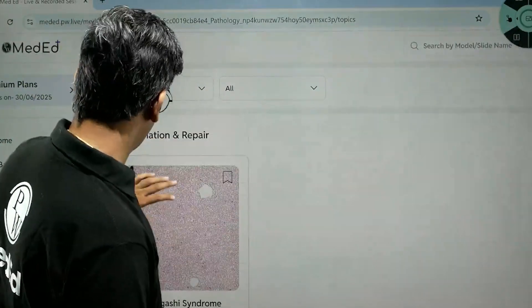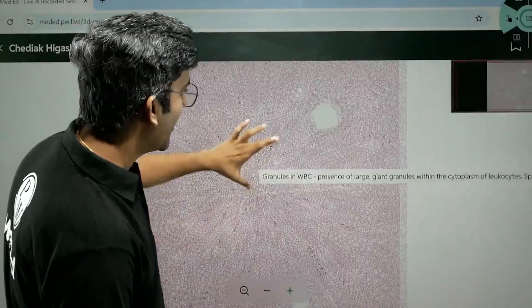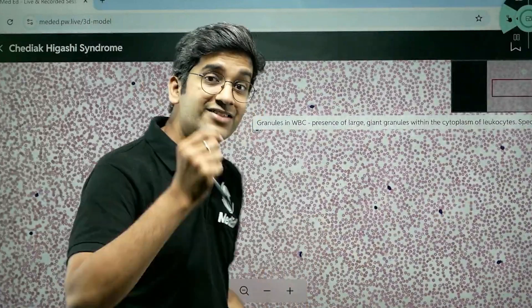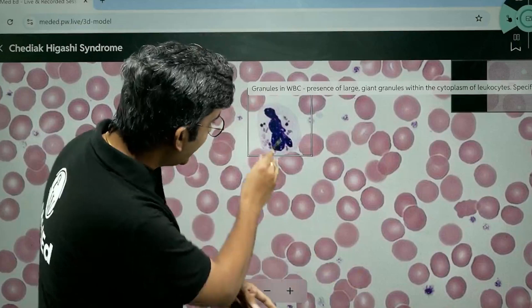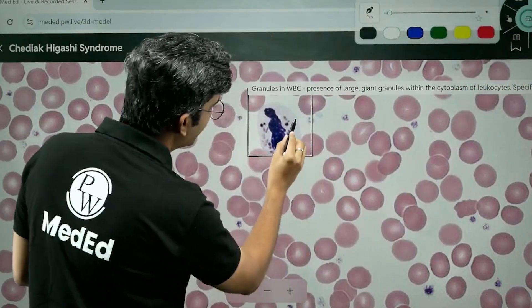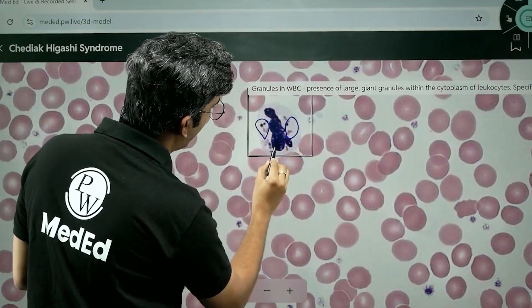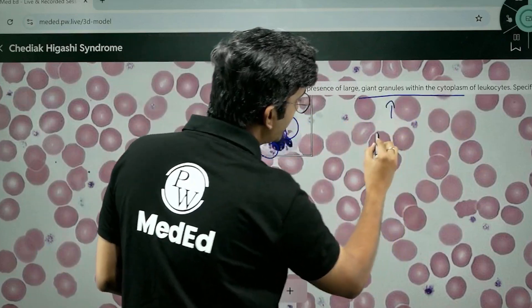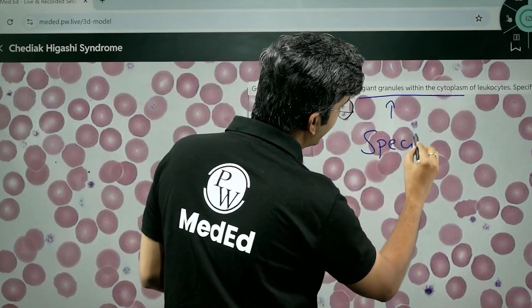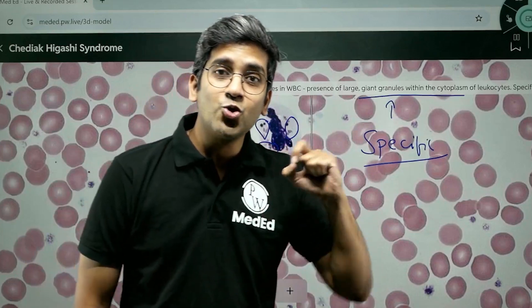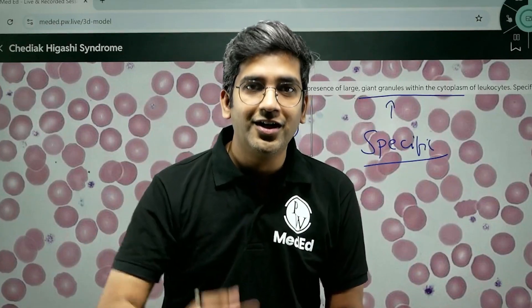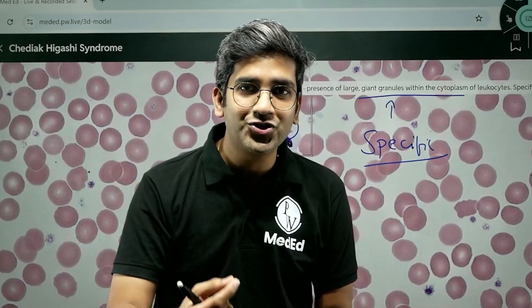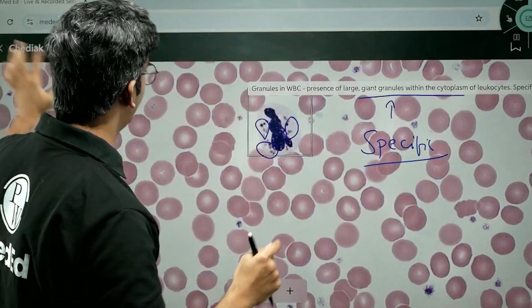This is one of my favorites: Chediak-Higashi syndrome. Though we haven't seen many cases, it's a very unique finding. If you look at the WBC, inside you can see these abnormal granules — that's a very specific finding of Chediak-Higashi syndrome, and it's a PYQ as well. So hereafter, no need to worry. For preparing the IBQ, learn as you go — second year, see the slides, reinforce the concepts, never forget it. That's the entire goal of the digital slides.